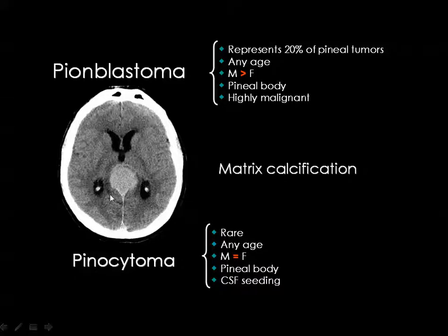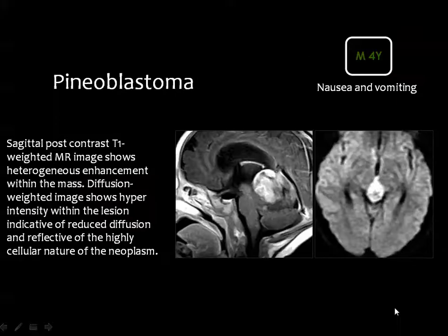You find a lesion in the pineal body and this lesion may represent any one of the pineal tumors including germinoma and including teratoma, but the fat is not apparent in the tumor. But if the fat is well demonstrated, then you think of the teratoma.